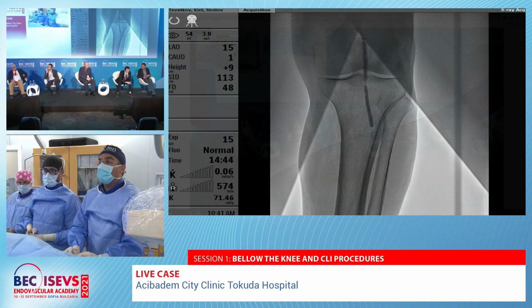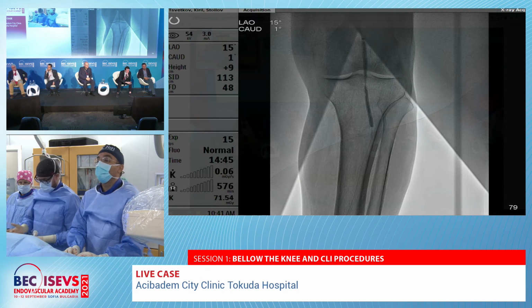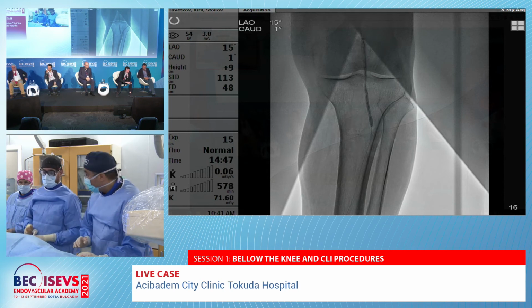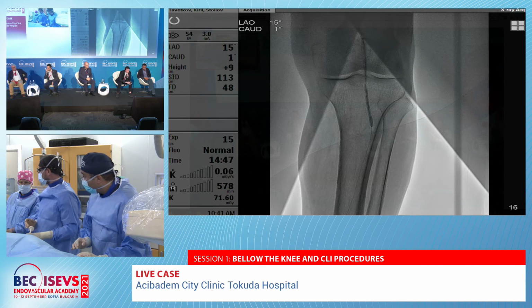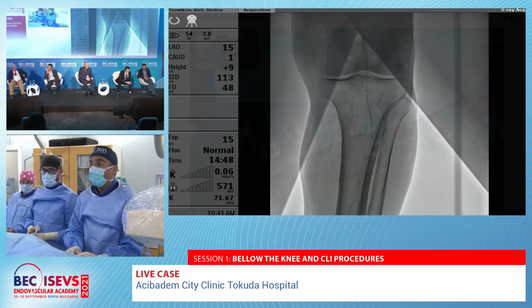I have another question for you. Yes, please. You said the first stent, then DCB. For how long do you keep the DCB inflated after you have stented? 2 minutes.